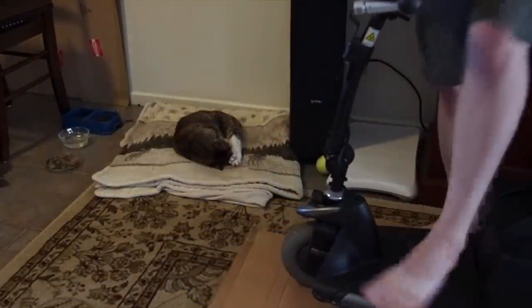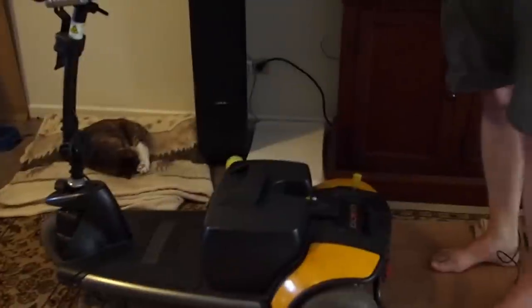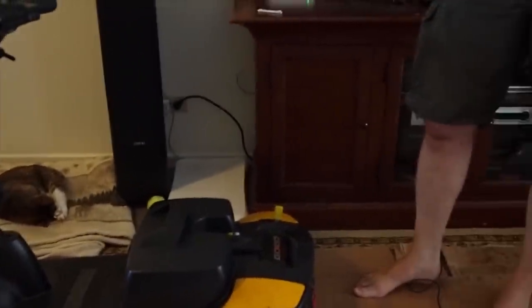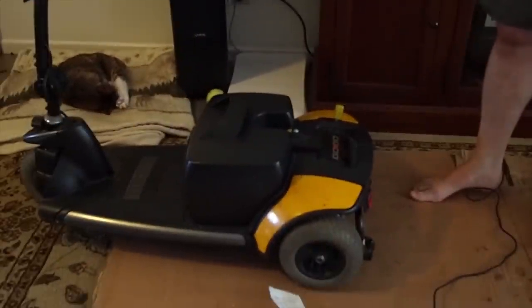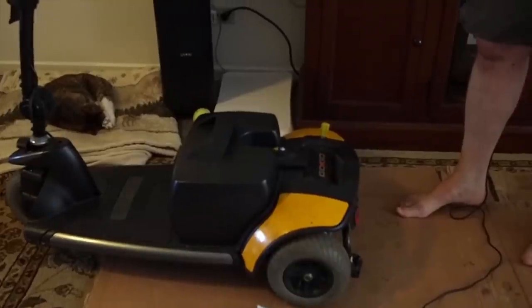Okay, so I think it's better. I think it's better than it was. I can hear a little bit of a noise, but it's not the grinding sound that it was. So Sherry's wondering if it's going to have greasy wheels. No more greasy than they were before. Nothing was really on the cardboard. There you go. We're going to call this one done. And I believe that the sound is gone.